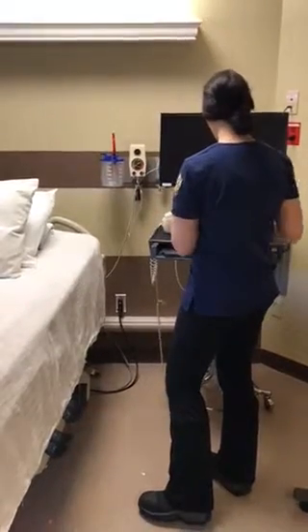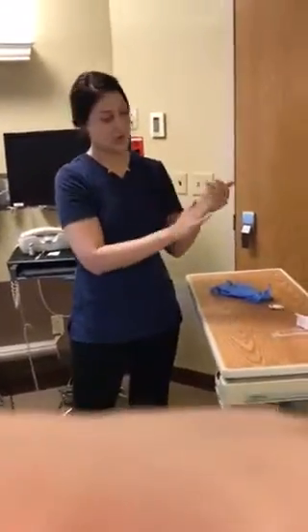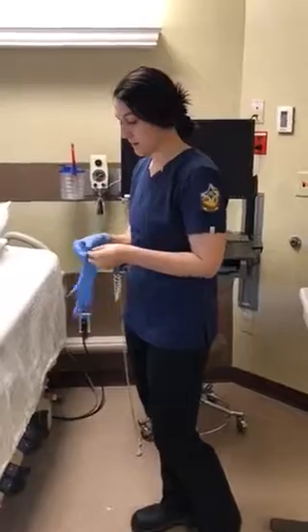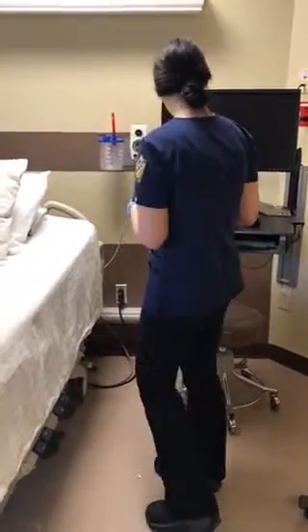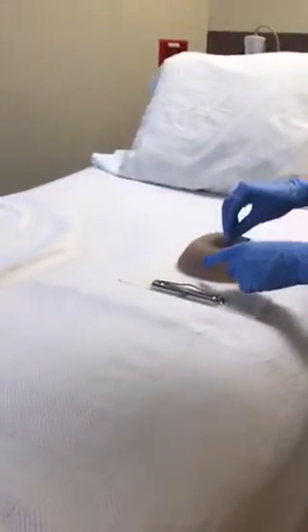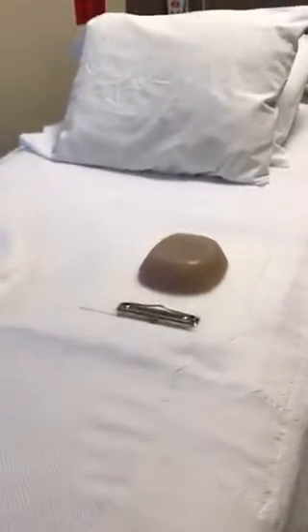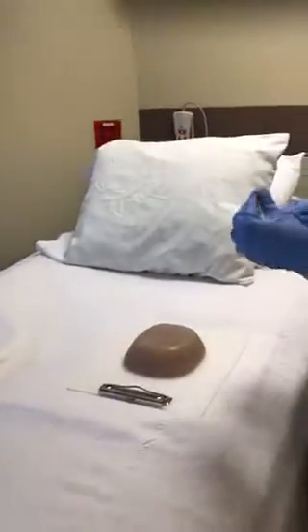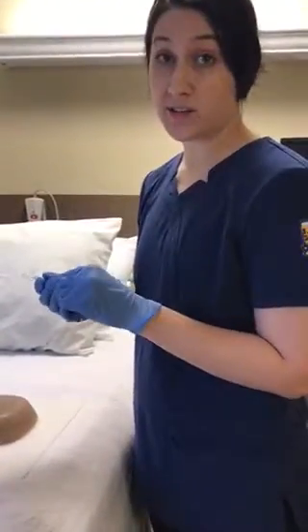So that is correct. The next thing I'm going to do is wash my hands, dry my hands, and then apply gloves. Bob, I'm going to have you lift your shirt there for me. Okay. All right. I'm going to take my alcohol pad and clean the site from inside out, circular. Okay, dispose of that pad. And while that is drying, I'll get my needle ready. Because Bob is a little bit overweight, we're going to administer the insulin at a 90-degree angle instead of a 45-degree angle.